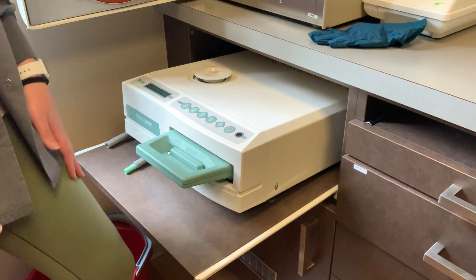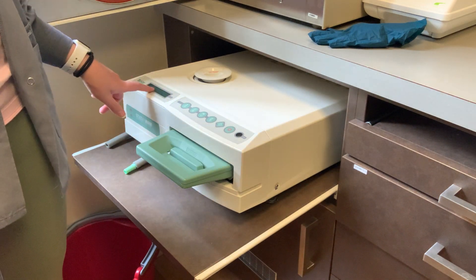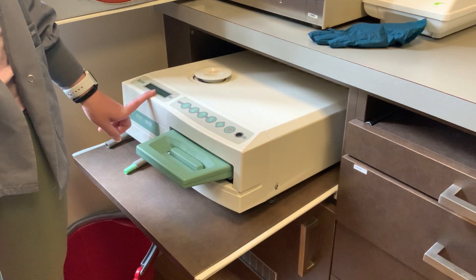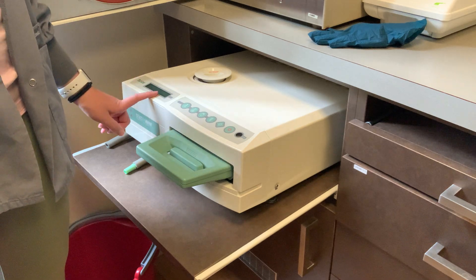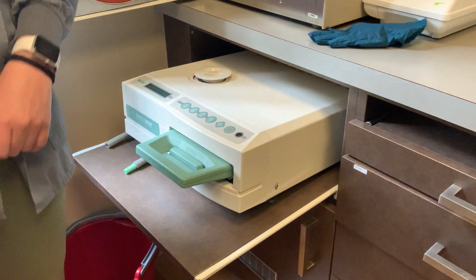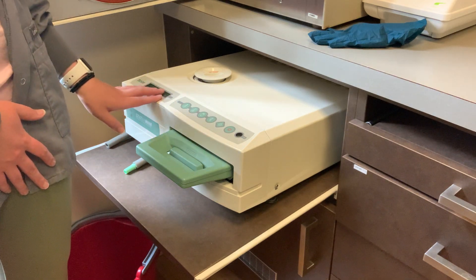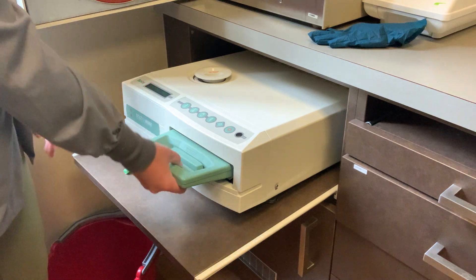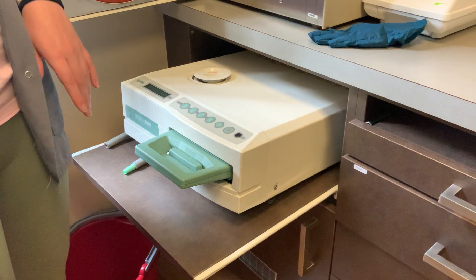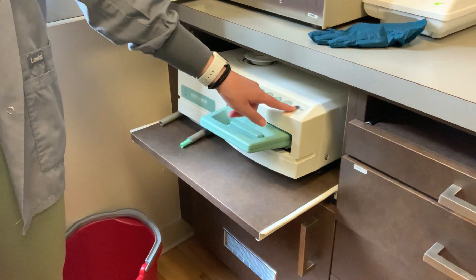The biggest thing with using the Statim is to always check your screen before pulling the cassette out. It's not uncommon to get an error message that says 'instruments not sterile, re-sterilize.' You don't want to just pull it out, grab your things, and run, only to realize it wasn't actually sterile. If it does say instruments not sterile, just hit stop, pull the cassette out, push it back in, and rerun it — then you should be good. Always check that screen.